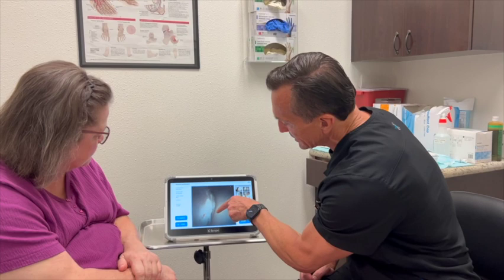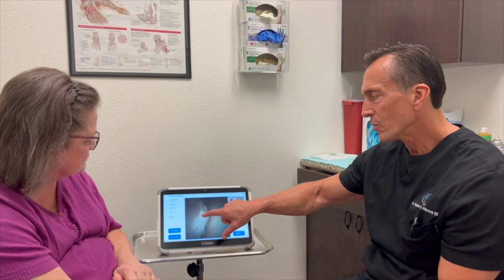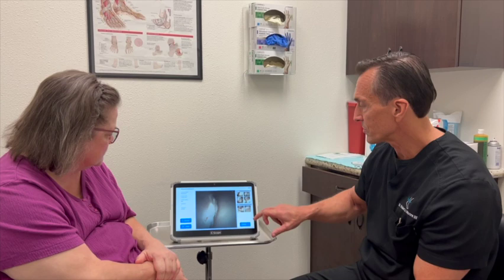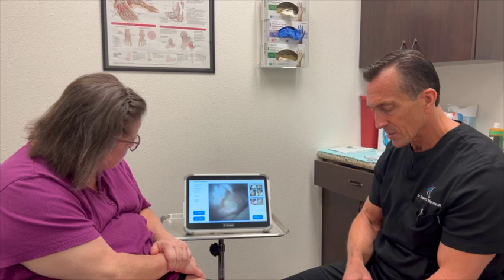You might have some what we call subchondral fracturing right there, which is a little bit of the bone getting fractured — that trabecular honeycomb-like bone that feeds the cartilage. So again, it would just be a trim job, and if for some reason it's something more serious, there's other options.